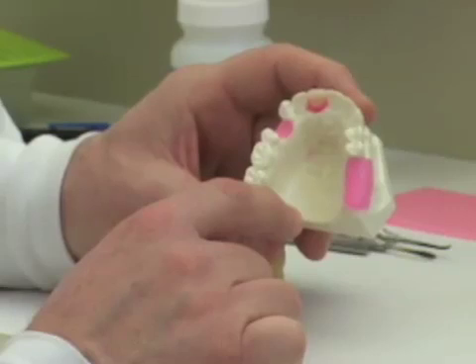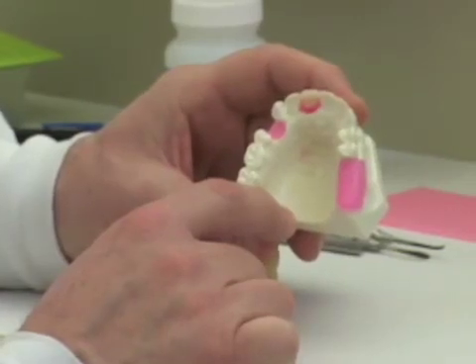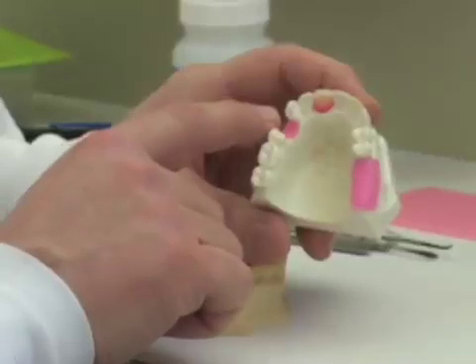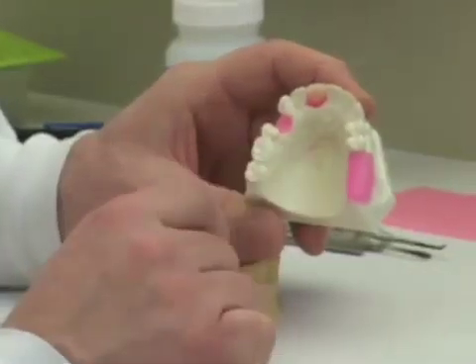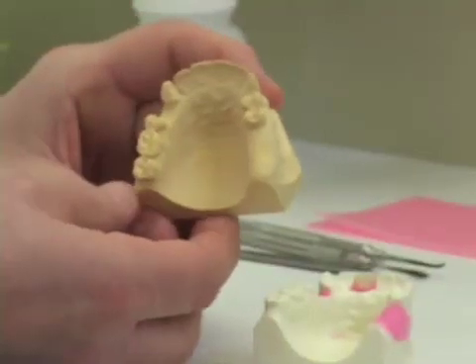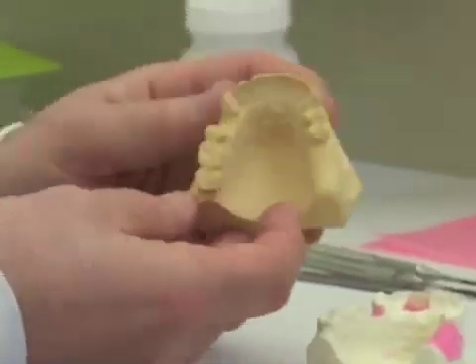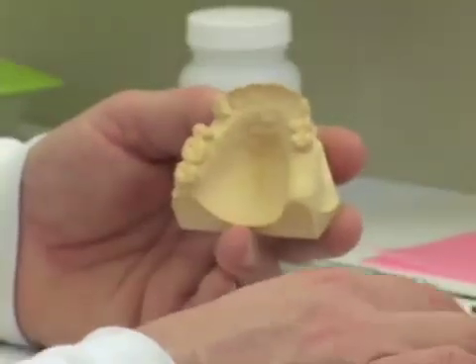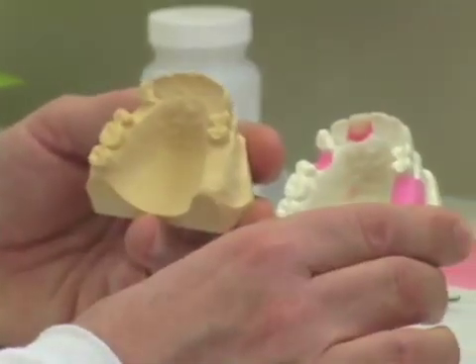We will demonstrate the fabrication of the radiographic or x-ray guide, first for the single-tooth area and for the two-tooth area. If this were an actual patient, the first step of preparing for our x-ray guides would be to secure a good impression and model of our patient.